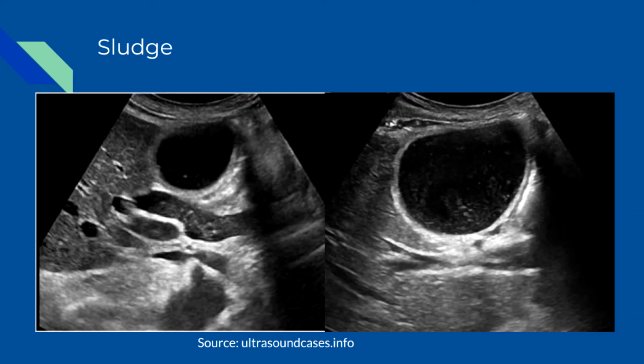On ultrasound, you'll see low-level echoes to echogenic debris that layers in the dependent part of the gallbladder and is mobile with patient position.